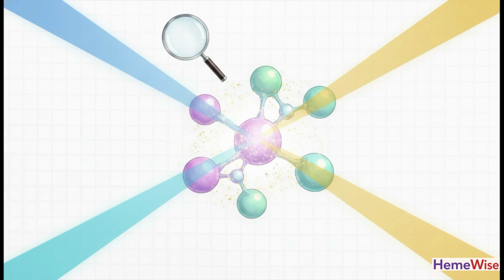So the crucial point is this. It brings us to the golden rule of the lab, orthogonal separation. Because different hemoglobin variants can act exactly the same under one single analytical condition, you absolutely must use 2 different physical-chemical methods to confirm an ambiguous phenotype. If your HPLC spits out a weird peak, you confirm it with capillary electrophoresis, or acid electrophoresis, or even molecular DNA testing. You never, ever rely on just one single dimension of data.